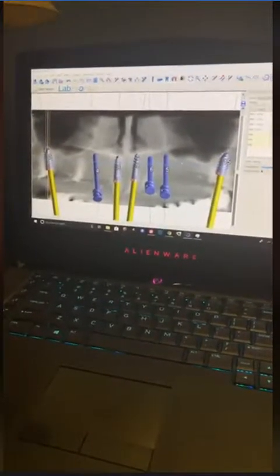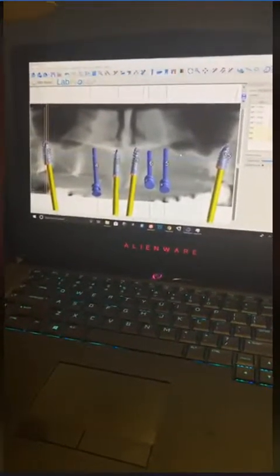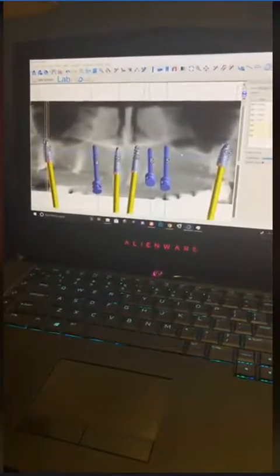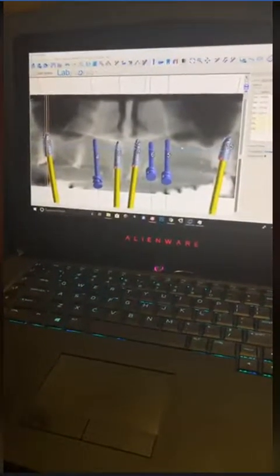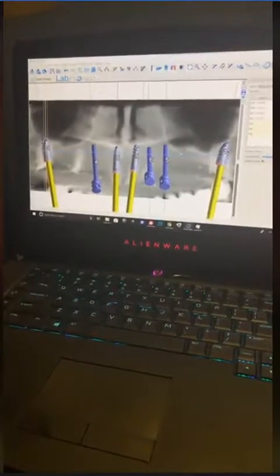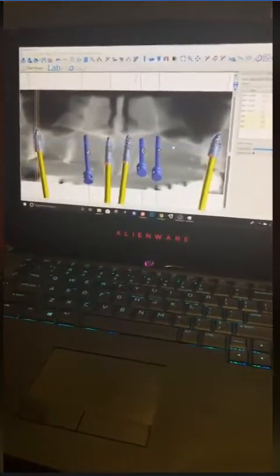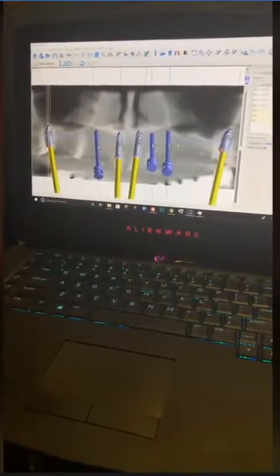Most people think immediate denture, I'm going to take out a tooth, stick an implant in where the tooth was. Most of the time, the apical portion of the implant is not, or should not be, at the apex of the existing tooth. You have to move it. The implant needs to be on the lingual section of your osteotomy and not dead center where the apex of the tooth was. So naturally what happens, when you're placing it in the lingual position, it generally wants to move into the path of least resistance, which is to the buccal.